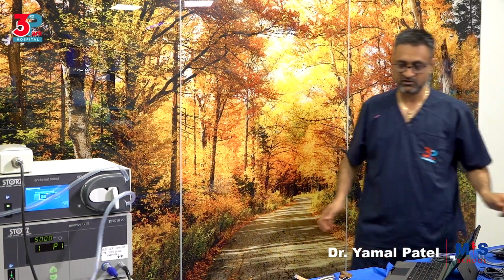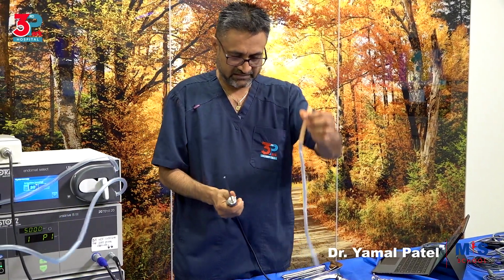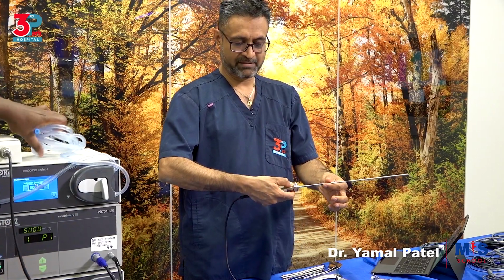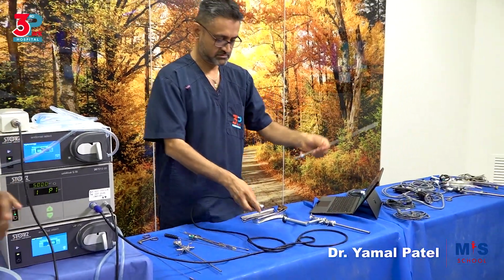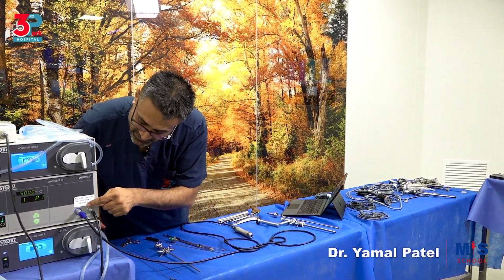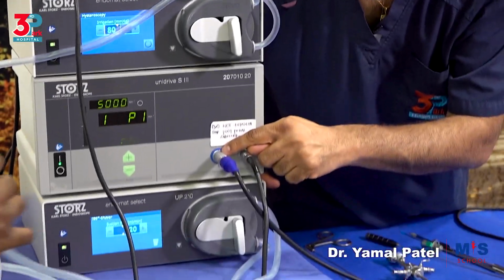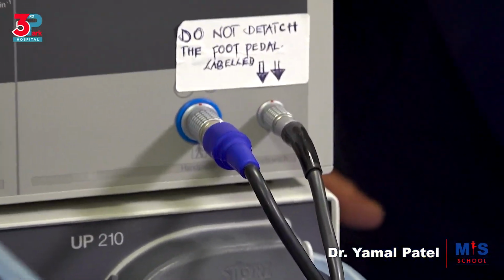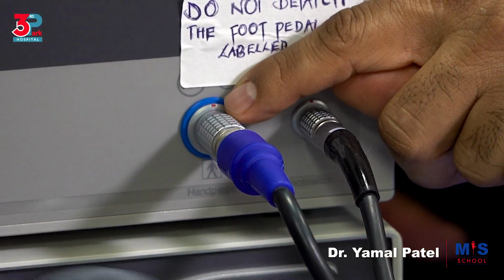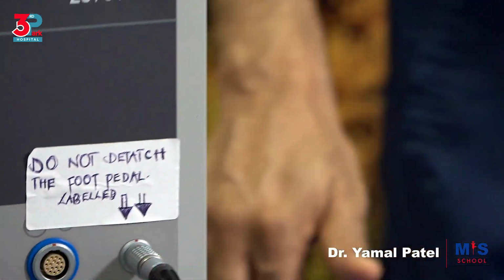So that is about your tissue retrieval system or hysteroscopic morcellator. When disconnecting it, again, you would pull this back and then this comes out. No forcing. And same here, when connecting this, there is a red dot that connects in line with each other. If you adjust it in any other way, you will break the pins. So the red dot with the red dot should be the way to connect that in.